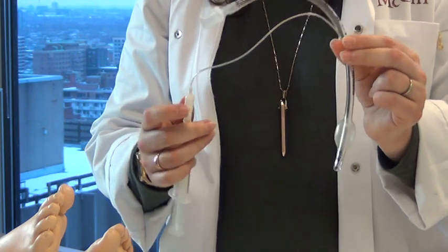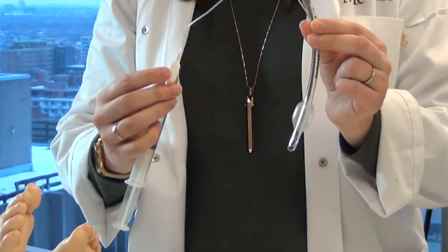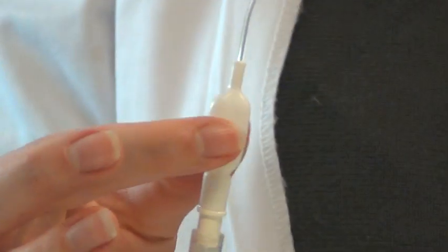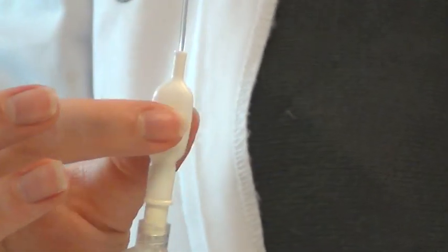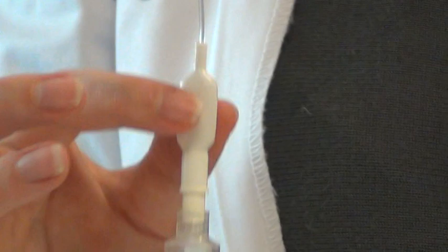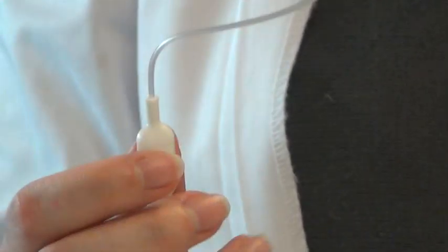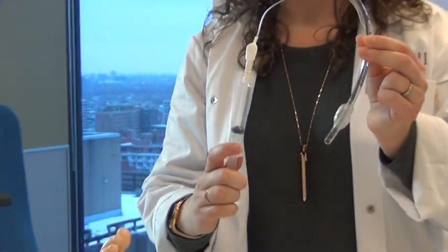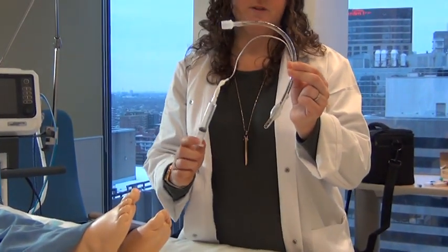The way that we assess the balloon is actually with experience, by just feeling the tip of the balloon that's outside the mouth over here. If we're able to squish it and it comes back to its original shape, usually that's properly inflated. If we press on it and it's very difficult to press down, it's usually overinflated. And if it's completely flat, that's underinflated, obviously.